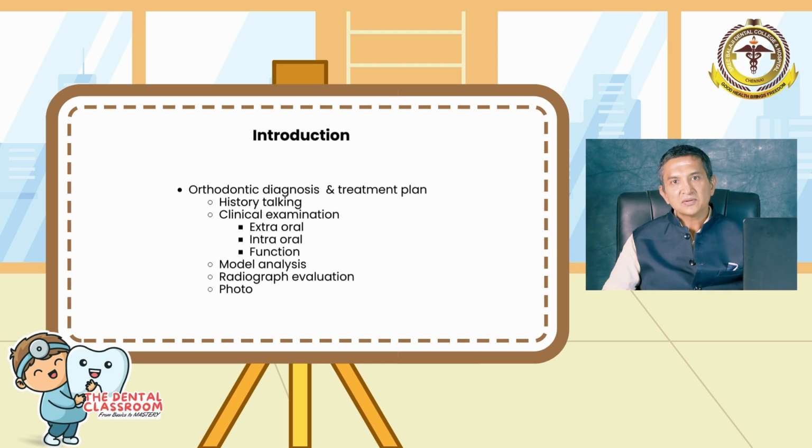So the Steiner's cephalometric analysis, or any cephalometric analysis for that matter, is a part of a diagnostic aid which is classified into either essential, as the name indicates it's compulsory, or supplemental, as the term indicates it is used when we do not get conclusive evidence with the essential diagnostic aids. Cephalometric is a Latin term, ceph meaning head and metric meaning measurements.